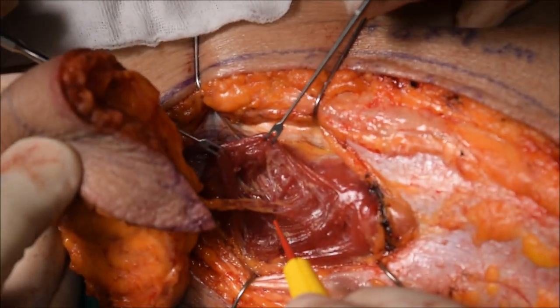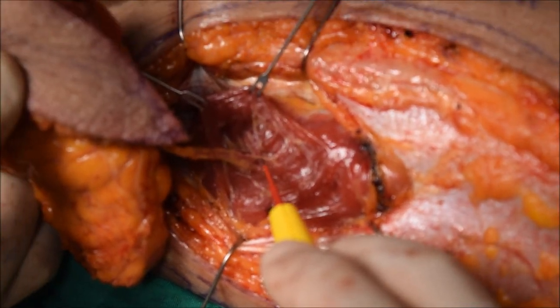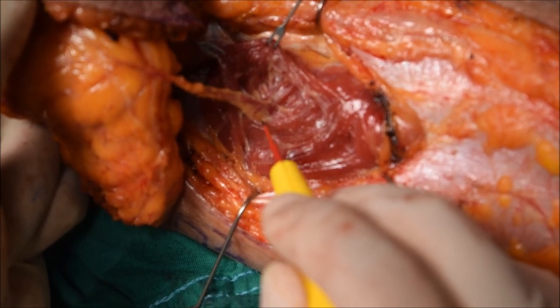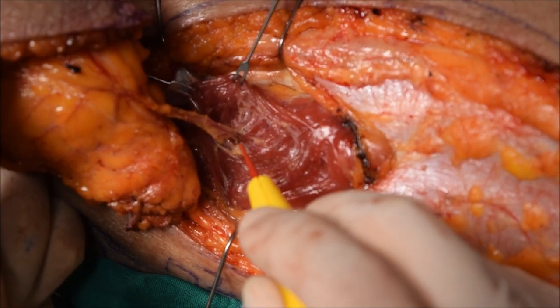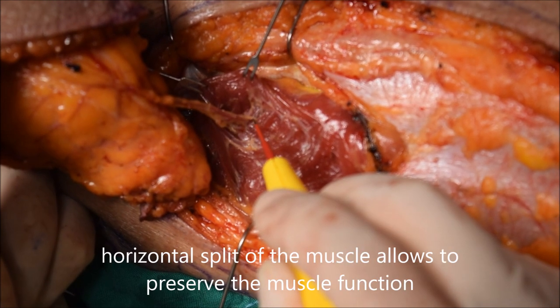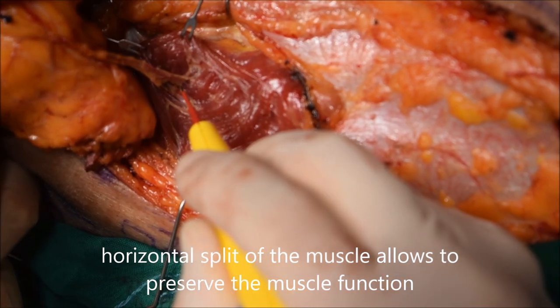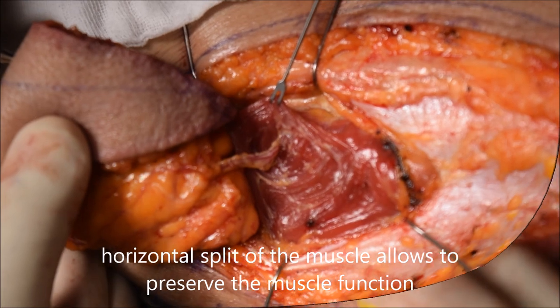Now the dissection heads toward the source vessel, in this case the descending branch. As you can see, we're not actually cutting through the muscle, but rather we're splitting along the muscle fibers, preserving maximal function. By splitting the muscle, this allows minimal bleeding compared to when you're cutting through the muscle, which has multiple branches within the muscle, adding to a more bloody field.